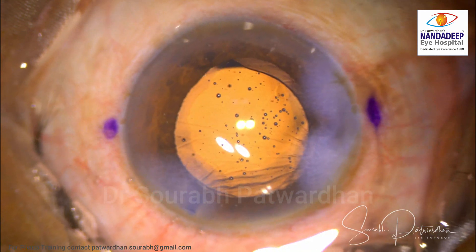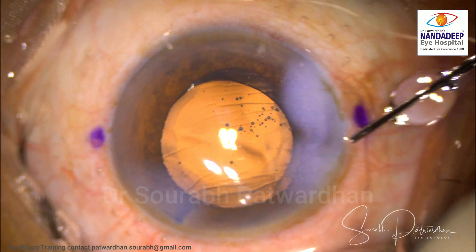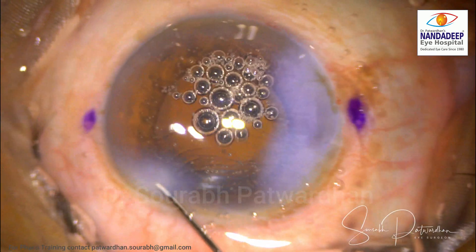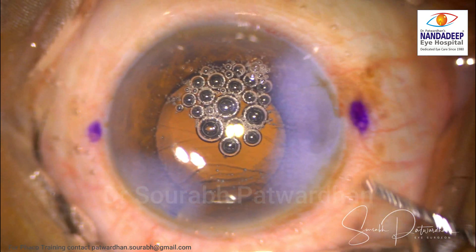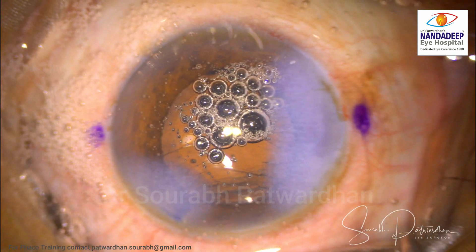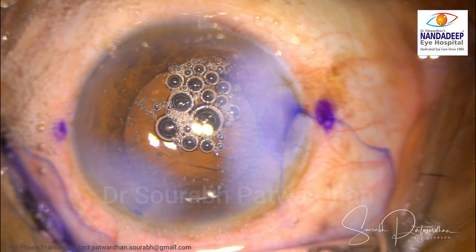I didn't notice this while I was doing the surgery, but when I reviewed the video I could notice it, though it looks very subtle. I continued with removal of the cortex, IOL insertion, removal of the viscoelastic, and then tried to close the incision as usual by hydration of the incision sides. With this much hydration and a well-constructed incision it usually seals off very quickly, but now I have to push more fluid because the AC is shallowing despite hydration, and the IOL is coming anteriorly, indicating there is a wound leak.